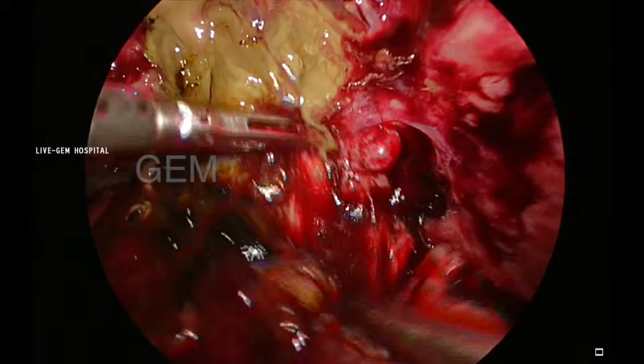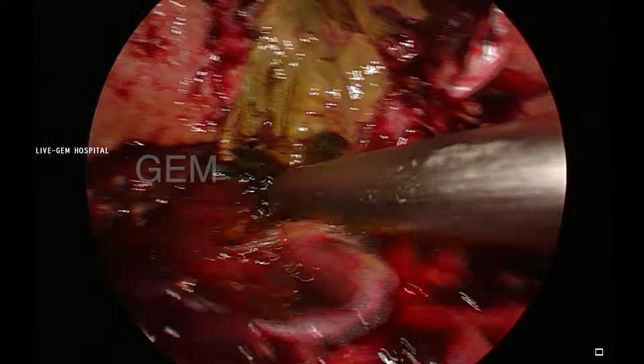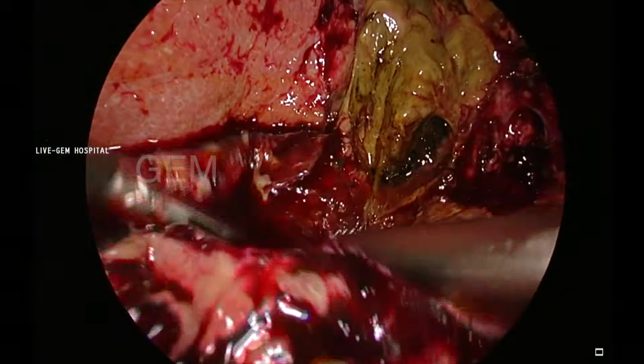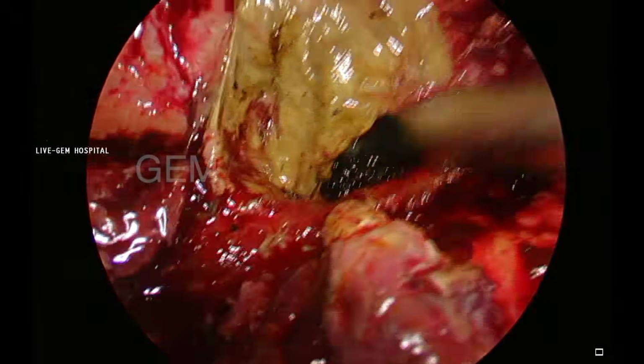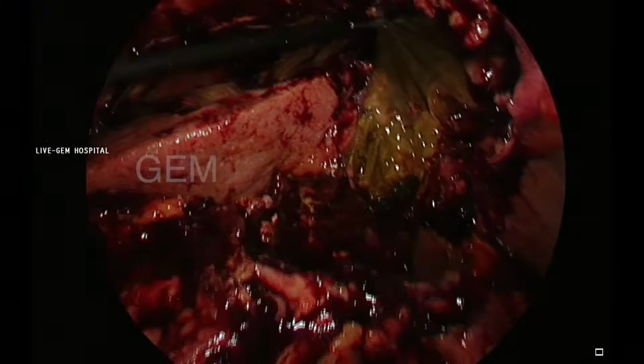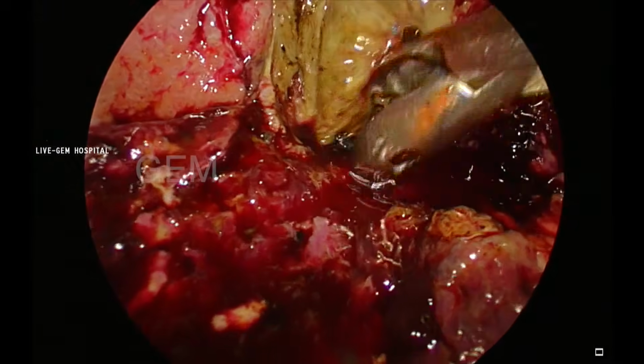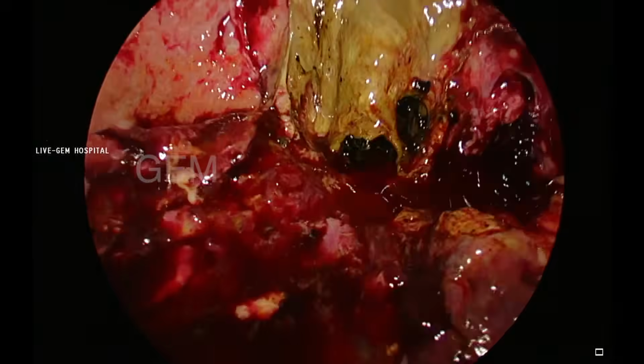So sometimes I use a 10 mm suction catheter. We have a 10 mm suction nozzle. So this is the 10 mm suction nozzle. We connect it to powerful suction, so we are able to suck out all the stones. This is an easier way compared with the stone holding forceps. Even though it's a 10 mm stone holding forceps, sometimes it's difficult.